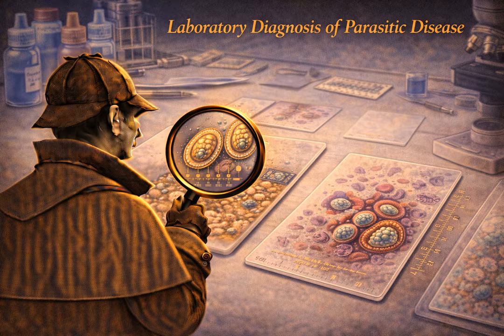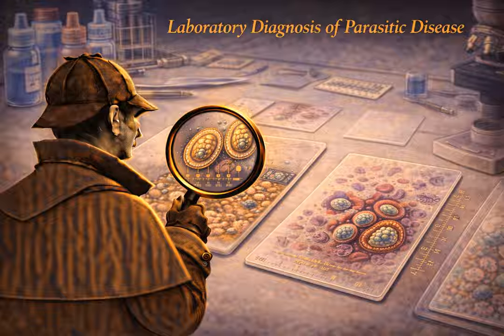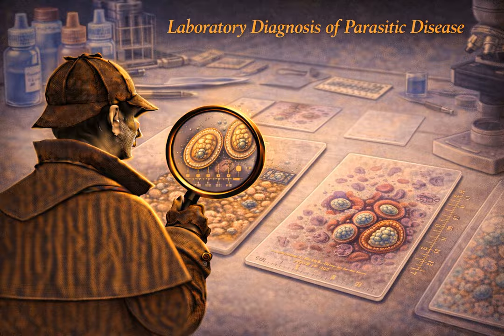You scan the microscope slide looking for that classic oval shape of an egg. That's the gold standard for O&P. If you do that exact same thing for strongyloids, you will fail. Because strongyloids' eggs actually hatch inside the bowel wall. They almost never make it out into the stool intact. What actually comes out in the feces are the larvae, the little baby worms, specifically the rhabditiform larva. So for strongyloids, the diagnostic form is the larva, not the egg.